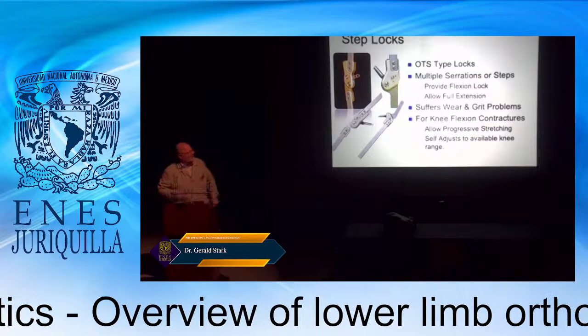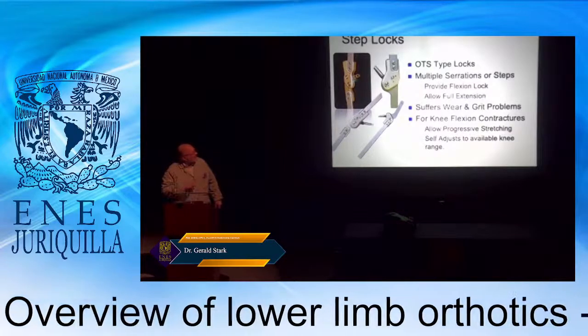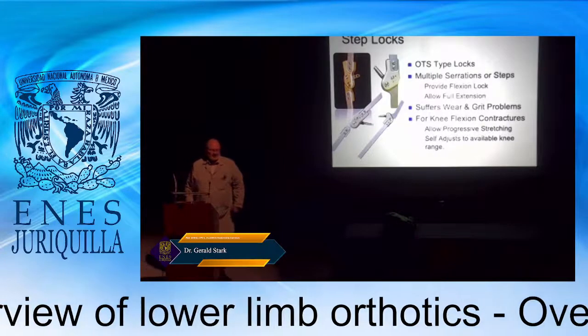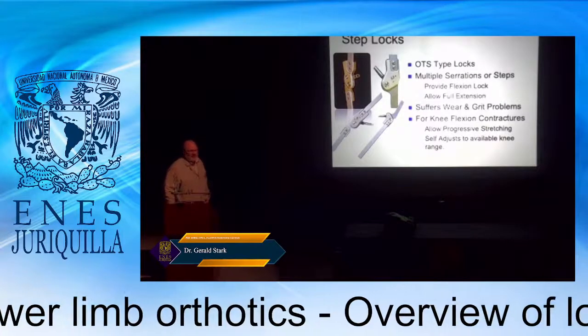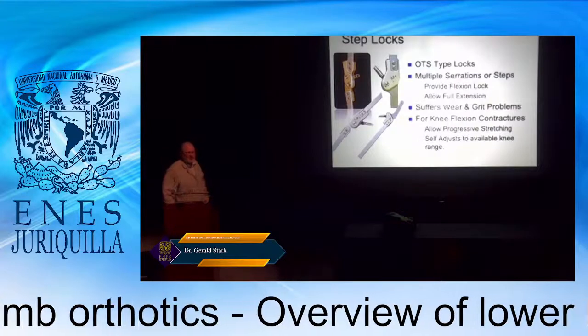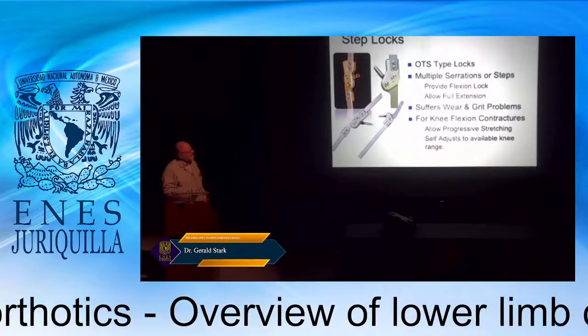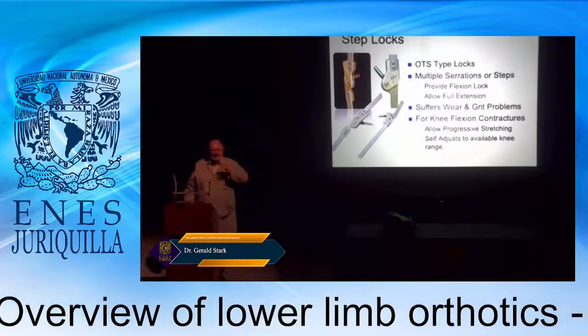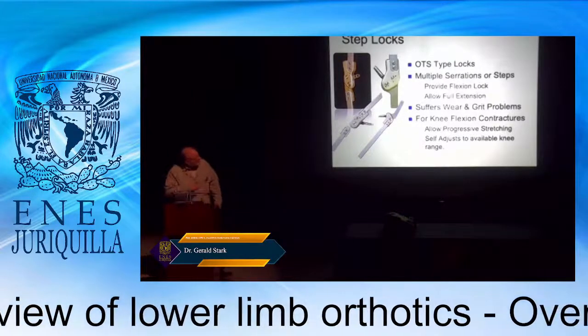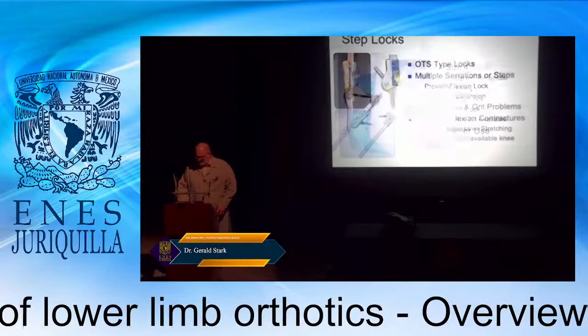A step lock is something that allows you multiple locking positions. And this is especially good for children if you don't get to full knee extension. If you can only get to within 30 degrees, this will still keep you safe and prevent you from falling. The downside, of course, is these little steps can wear out over time.